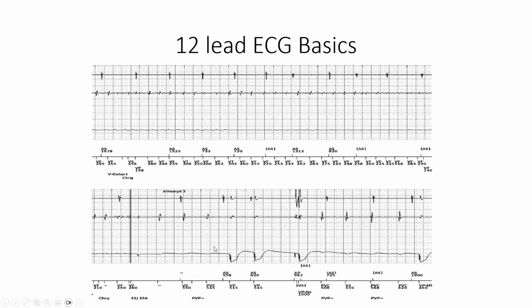Same thing with pacemakers. If you have a patient with a pacemaker or other implanted cardiac device and they're, say, in unstable atrial fibrillation or unstable narrow complex tachycardia and require cardioversion per ACLS protocol, again, those defibrillator patches are not going to hurt the implanted cardiac device.